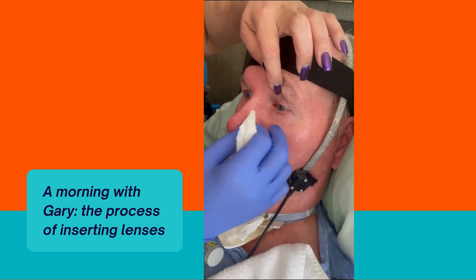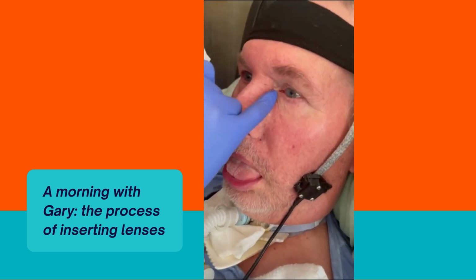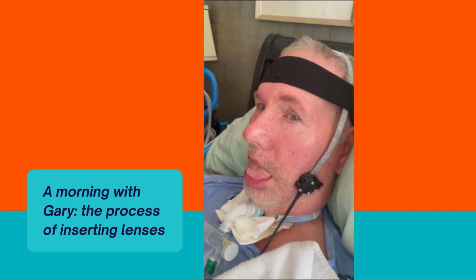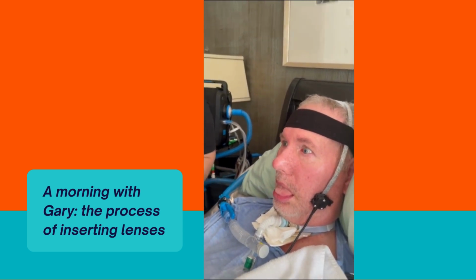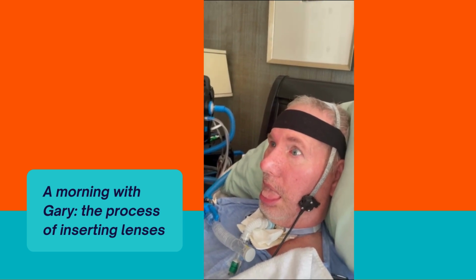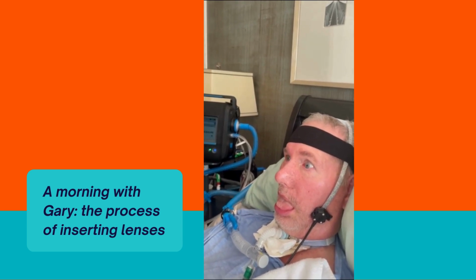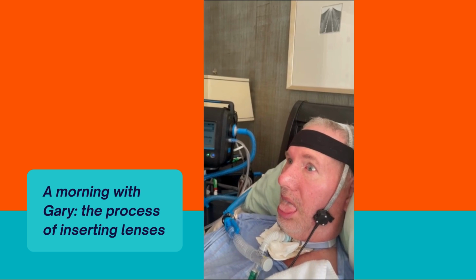You don't have to open, because when you cry, your tear ducts come right in this area, so it's going to start there. Most of it pools around the bottom, so you just start at the bottom and go across the bottom just like that. It will soak up the water pretty well without getting in his way. After we do eye drops, we often will do that, and then throughout the day we may do eye drops 2 or 3 times and do that dabbing again. During the day, for some unknown reason, we might get a bubble in, and he'll say bubble in right, bubble in left, and then we'll have to change and do this process again.